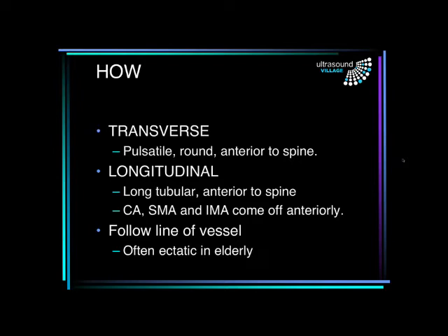In the transverse view, we're looking for a pulsatile, round structure that lies anterior to the spine. In the longitudinal view, we're looking for a long tubular structure that again is anterior to the spine, and we can identify the spine because of the scalloping shape of the vertebral bodies. If you get a good view, you may see the celiac axis and the superior and occasionally even the inferior mesenteric artery, although this is quite difficult and isn't absolutely necessary. As patients get older, the vessel often becomes ectatic and may not be in a nice straight line — it often bows off to the left.